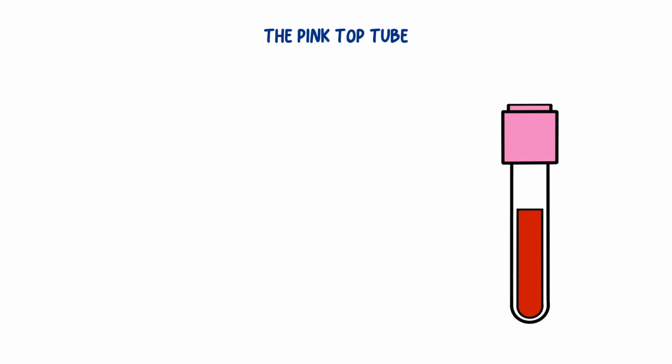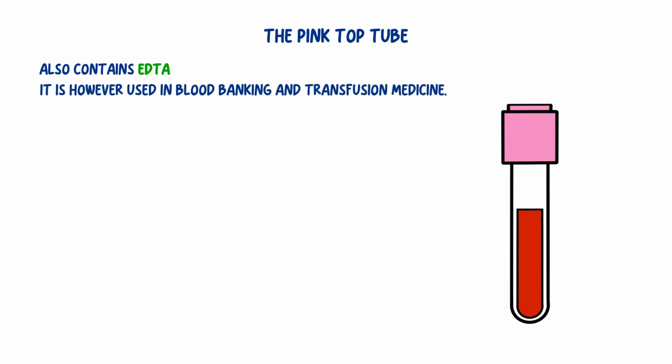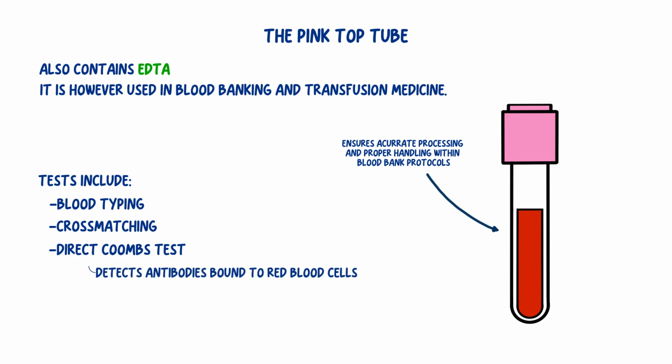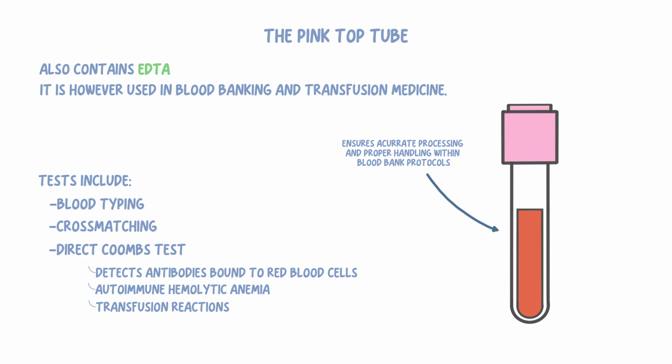The pink top tube also contains EDTA. However, it is primarily used in blood banking and transfusion medicine. This is because it ensures accurate processing and proper handling within blood bank protocols, making it the preferred choice for tests related to transfusions. It is essential for blood typing, cross-matching, and the direct Coombs test. The direct Coombs test is a critical diagnostic tool that detects antibodies bound to red blood cells, helping to identify conditions like autoimmune hemolytic anemia and transfusion reactions.